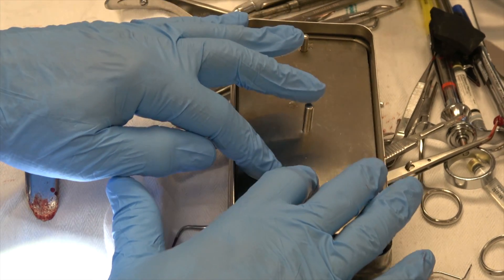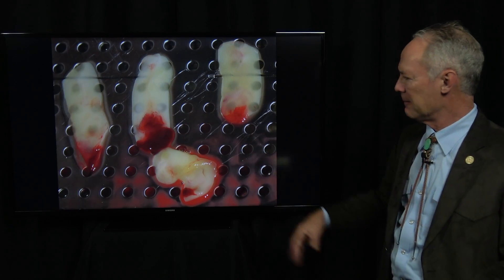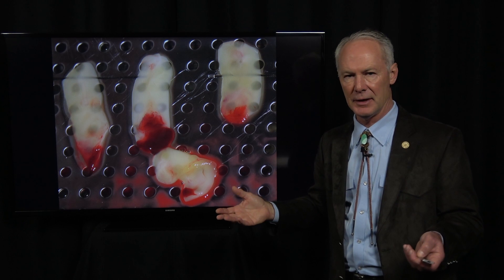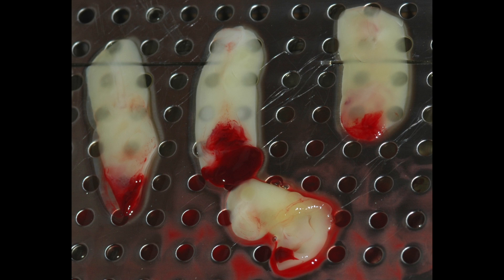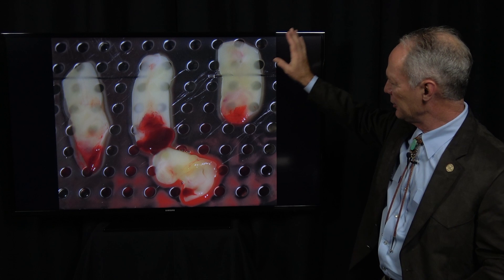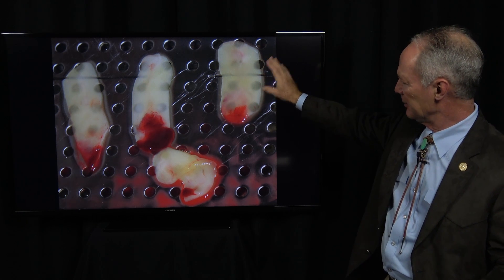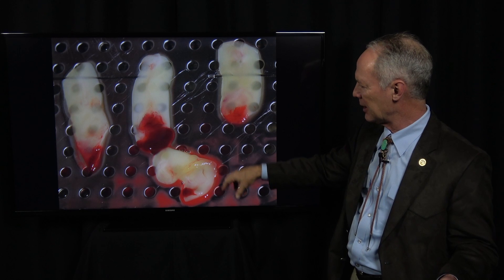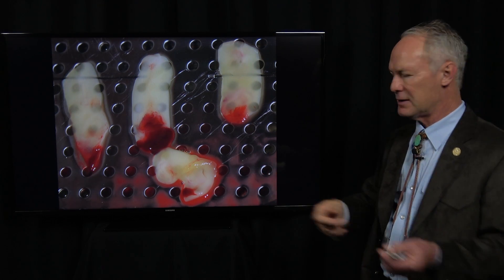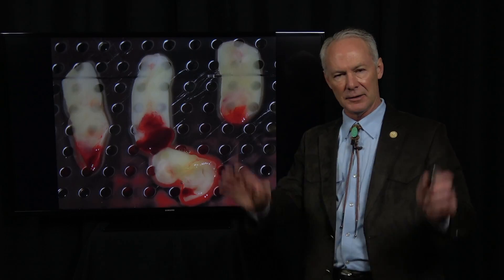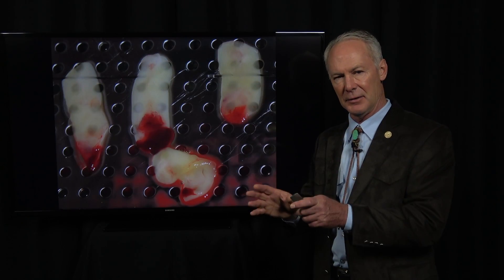Then we're going to put this lid on the tray and let that sit, and after about five or 15 minutes, it's going to flatten the PRF clots. And it also pushes the serum in the clots through the perforated tray, so you can draw that serum from the bottom part of the tray, and that's also high in growth factor, and you can use that to mix the PRF with the freeze-dried bone as the liquid part. So this video is on how to attain PRF.